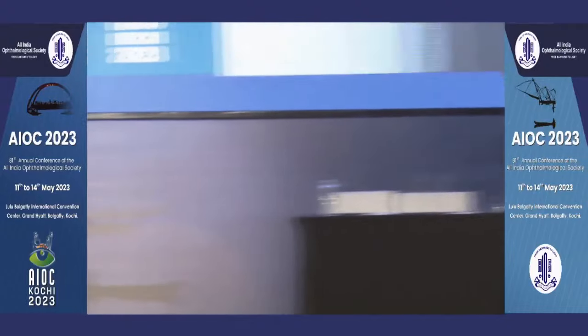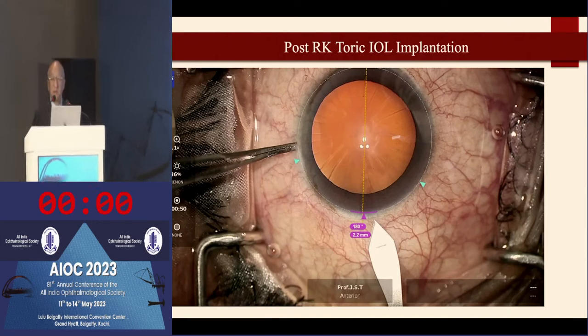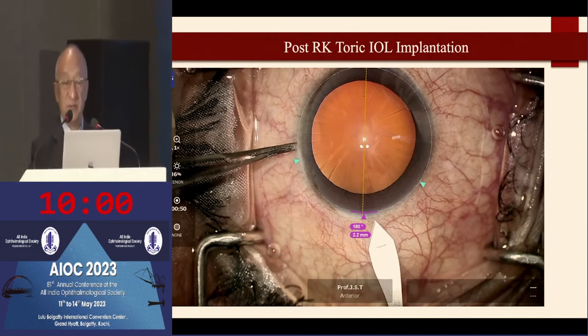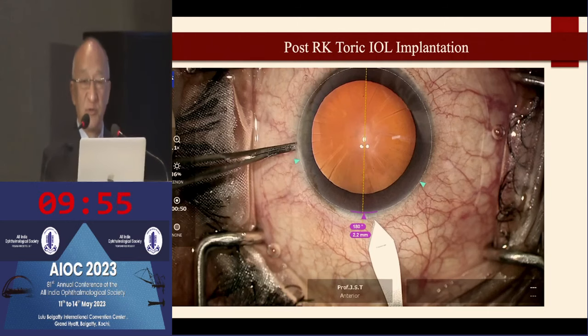Dr. Partha is busy with some other work, so he was supposed to cover phaco in the post-refractive surgery patients. So I'm going to show you one video because we do have a lot of patients with post-RK.